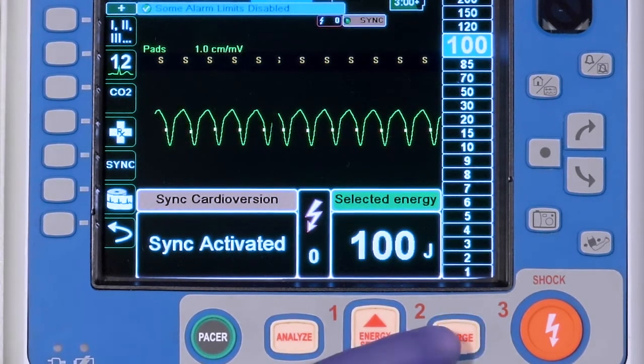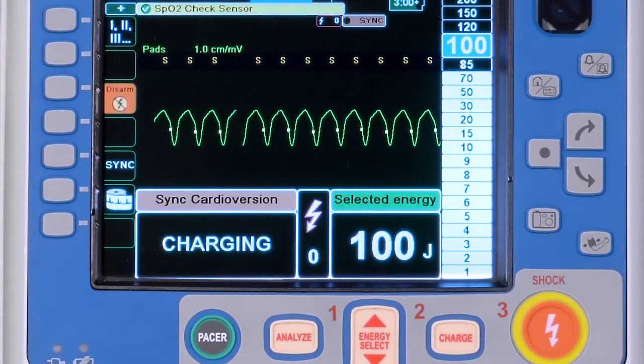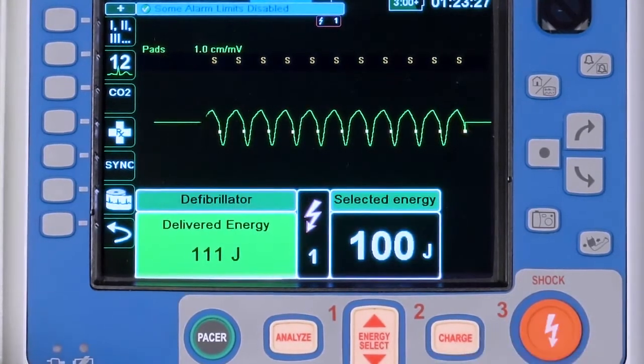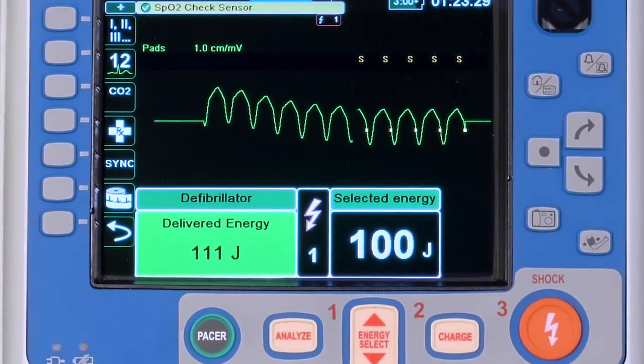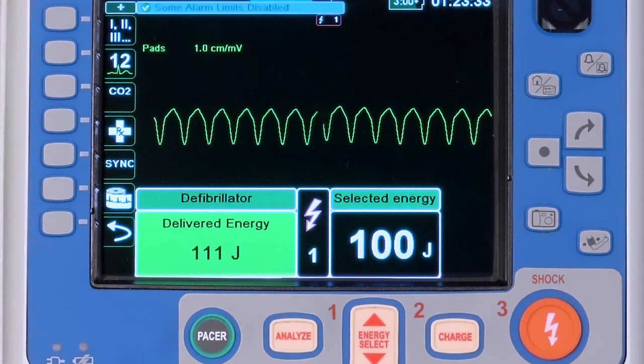Press the Charge button to charge to the selected energy. When the red Shock button is illuminated, push and hold the button to deliver the selected energy. This allows the X-Series Advanced to deliver the energy on the next highlighted R-wave.